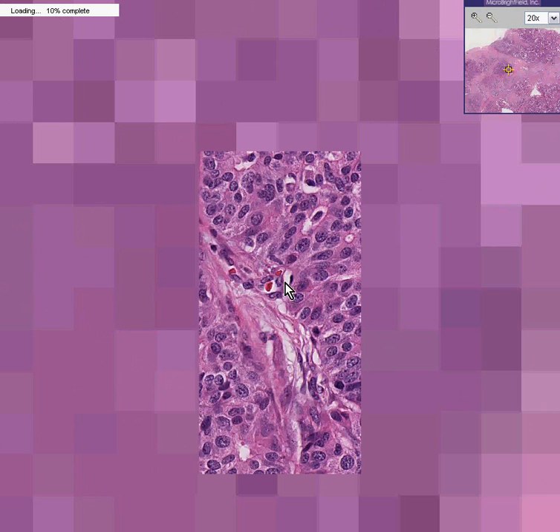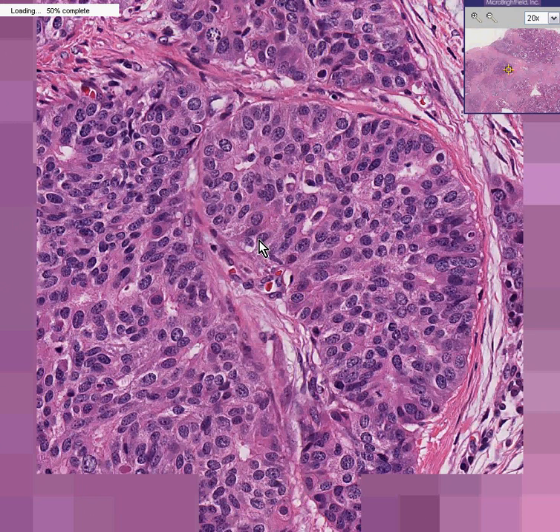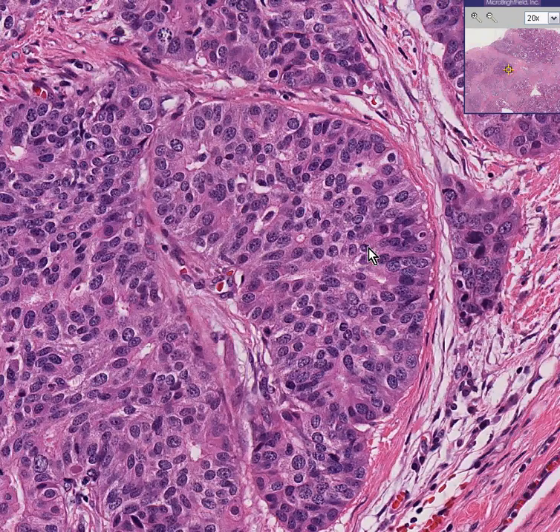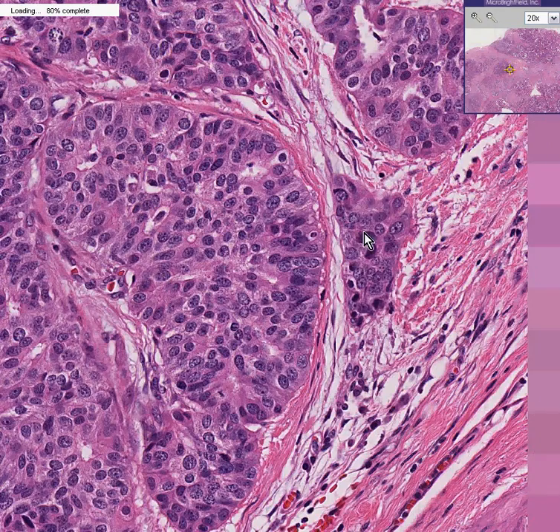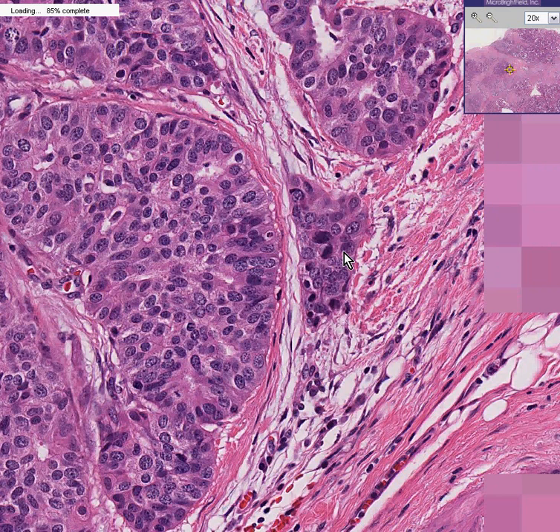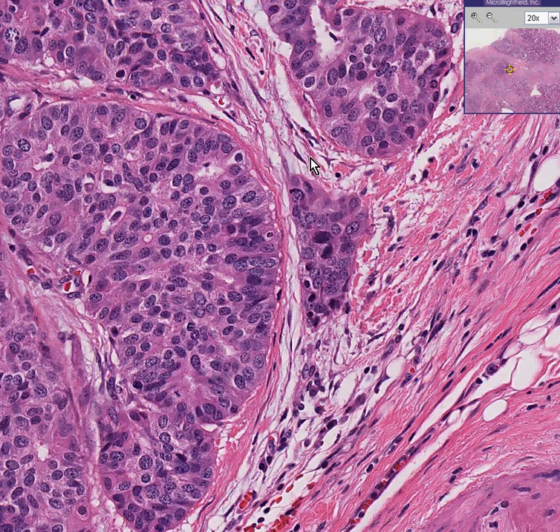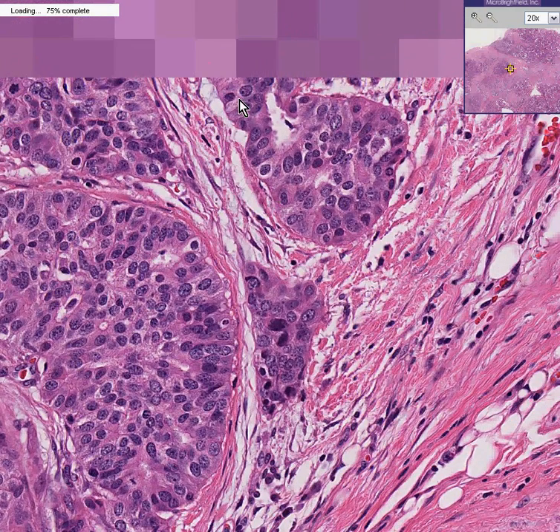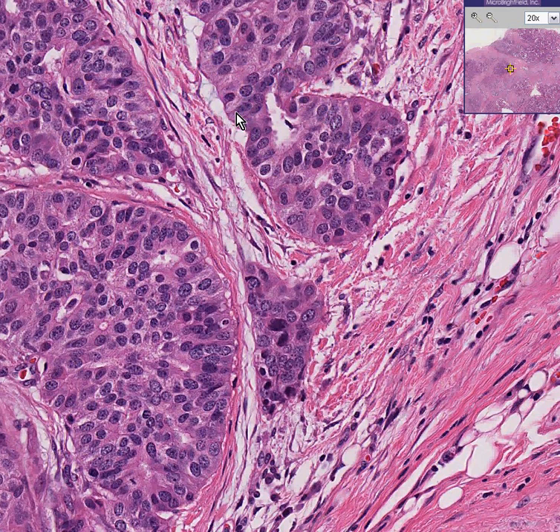You can see large, dark nuclei; you can see a very bizarre cell; you can see an increased mitotic rate — this looks like some kind of a bizarre mitosis over here. You can see infiltration, and although this general clump of cells here doesn't look like it's doing much, if you look around some more, you can see that many parts of the tumor appear to be making glands, by virtue of having a circular configuration or perhaps vacuoles inside of their cytoplasm.